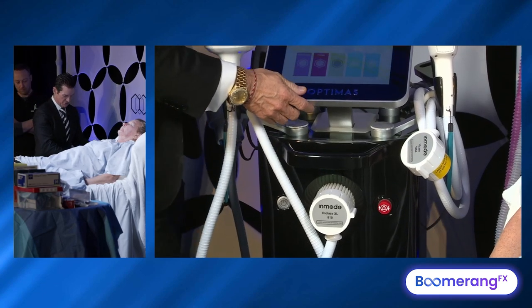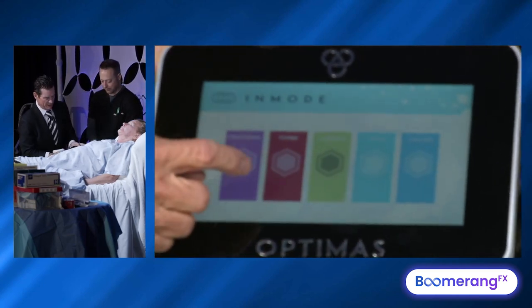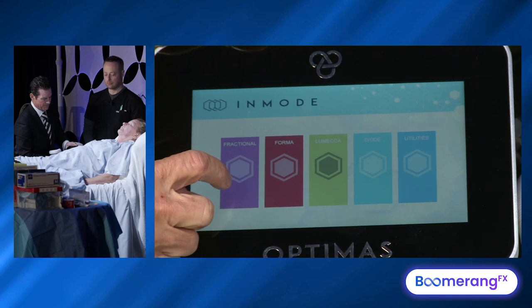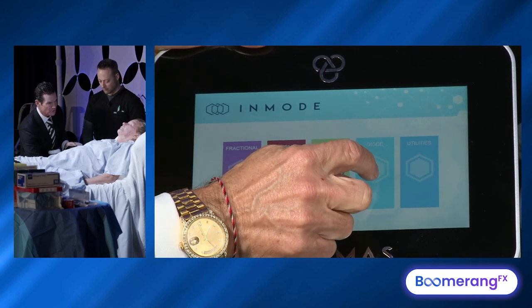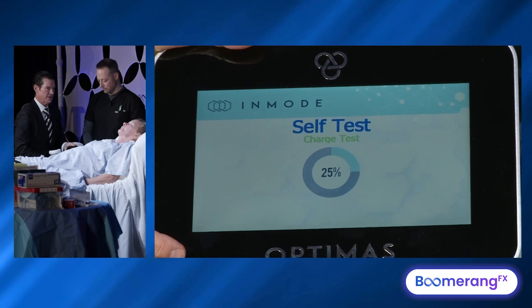Let's come up to our user interface screen. We've got lots of revenue opportunities. We've looked at her three-step lifting, Lameca, Forma, and the Morpheus. And we're going to go over here to our diode — that's also where you plug in your neodymium YAG.